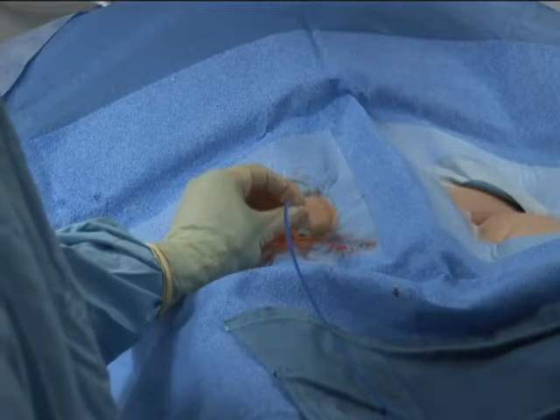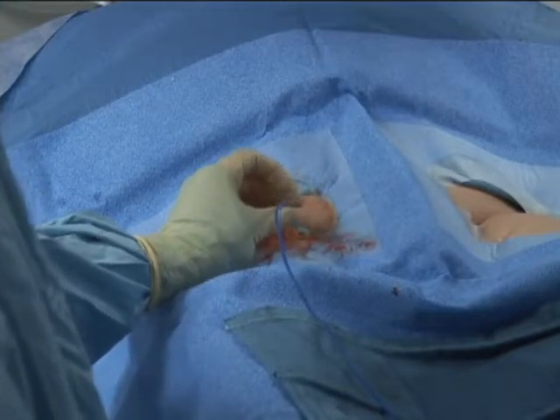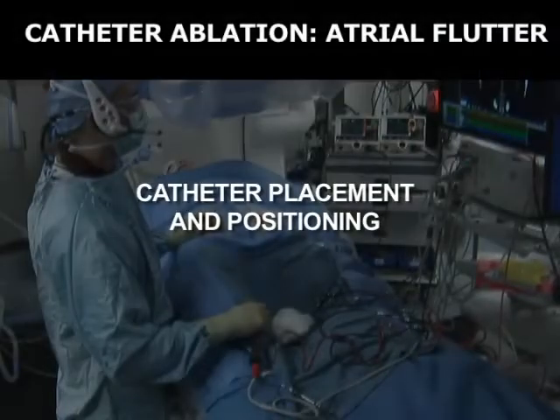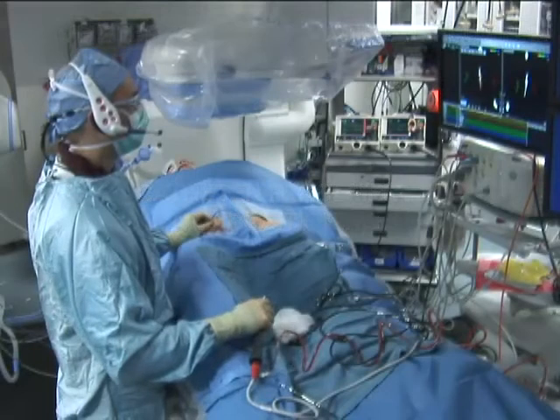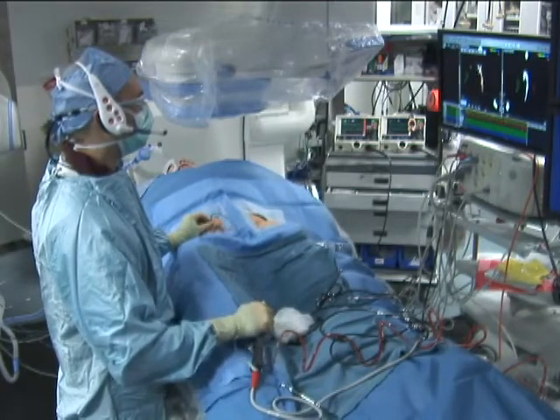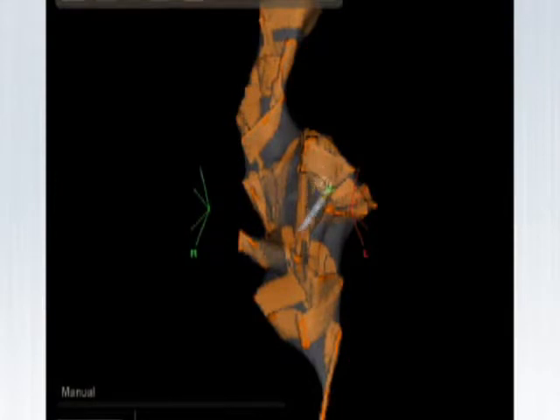Once venous access is obtained, the electrophysiology catheters are inserted. Catheter placement can be monitored using fluoroscopy or with a three-dimensional mapping system. Depending on the 3D mapping system used, the ablation catheter may need to be inserted first into the right atrium to make an anatomic map of the chamber.